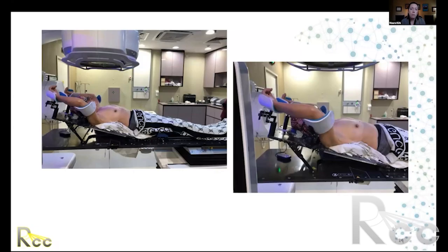But one benefit of having the patient angled is that you have gravity weighing the breast down and away from the chin. And gravity helps the breast to fall into a more reproducible position. I believe it used to be that you wanted to have the chest wall horizontal here. That's less critical when we're doing 3D conformal planning, because we have a CT of the patient and we're setting up the collimator angle to align with the chest wall, and we can use asymmetric jaws, field in field delivery. So the exact angle is less critical.